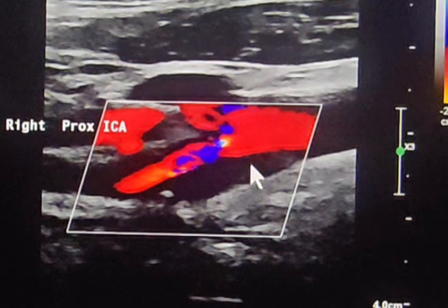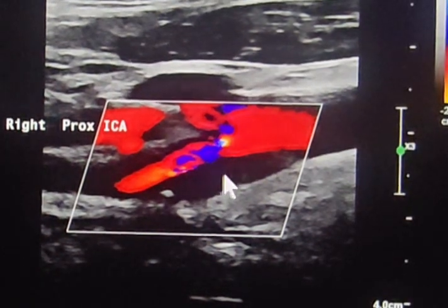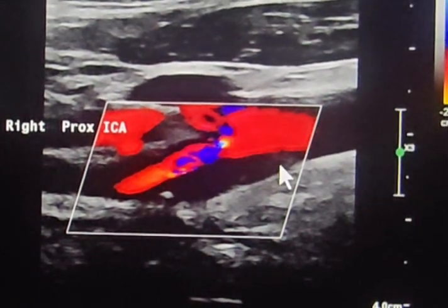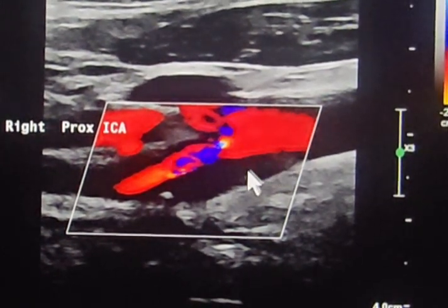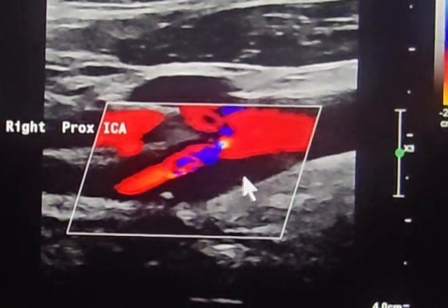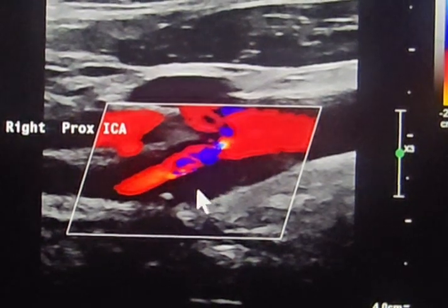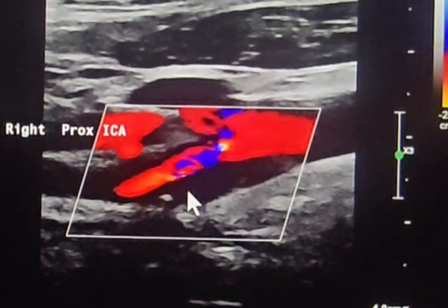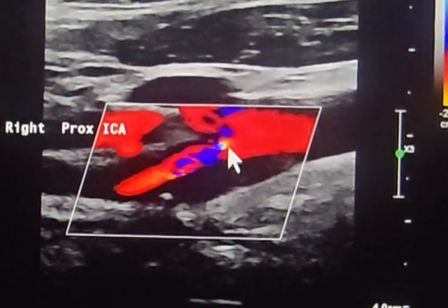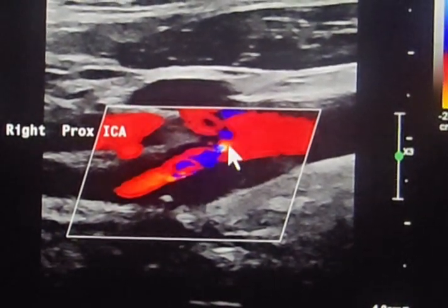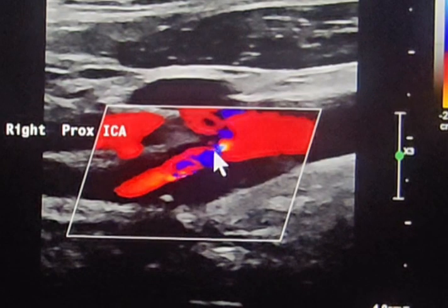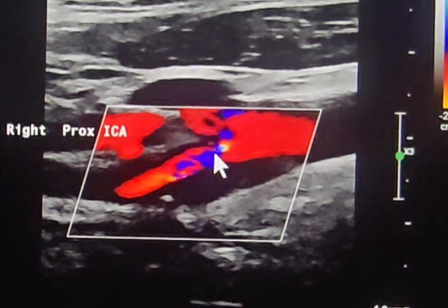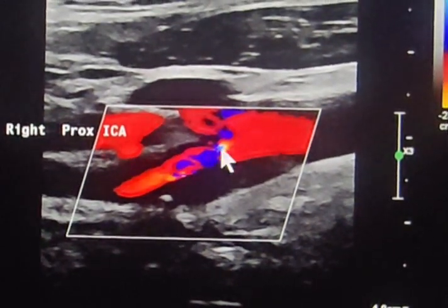Now we move to the internal carotid artery, and we can see that we have an atheromatous plaque from the origin extending to the proximal internal carotid artery. Also by color Doppler, we can see that we have aliasing.